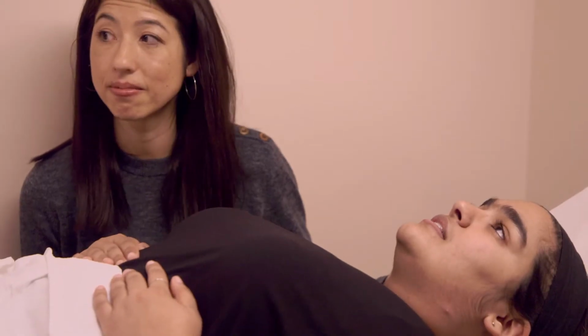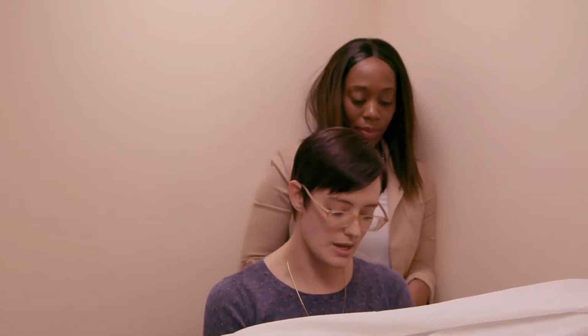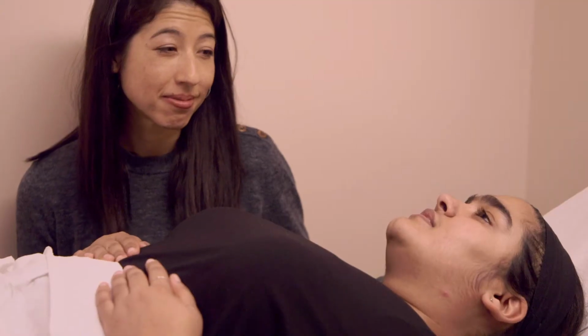Okay, I'm going to go ahead and insert the speculum. You're going to feel something cool, and you might feel some pressure.